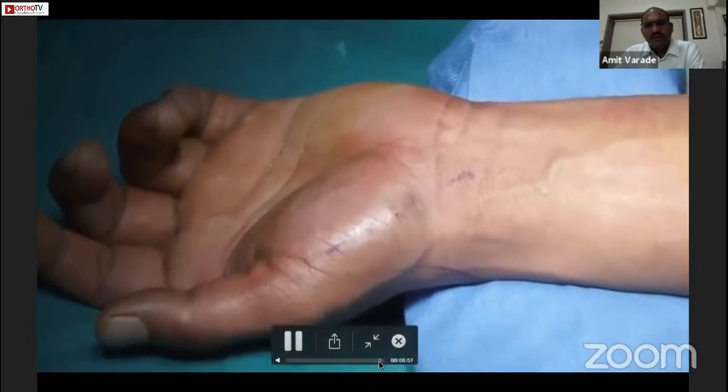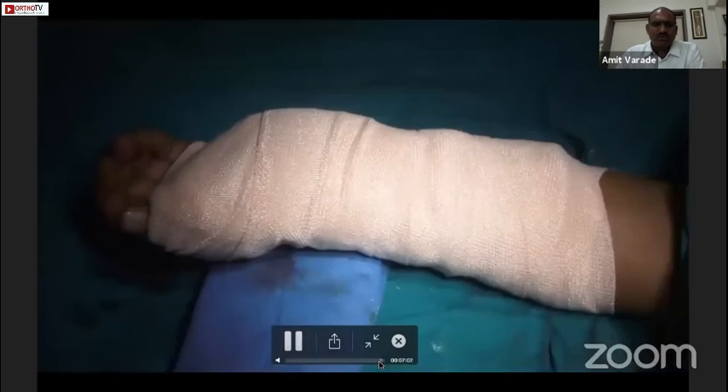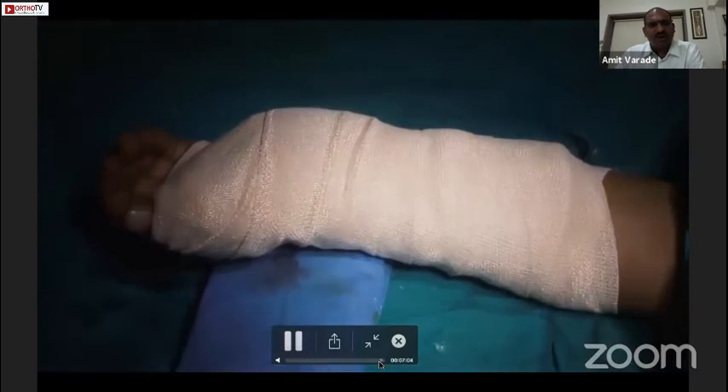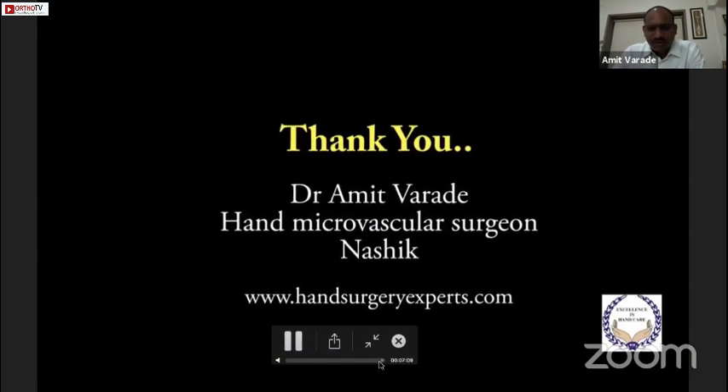If we look at the incision, it is a very small incision. We don't have to take a stitch — it will heal automatically on its own. We give a thumb spica splint. Thank you very much.